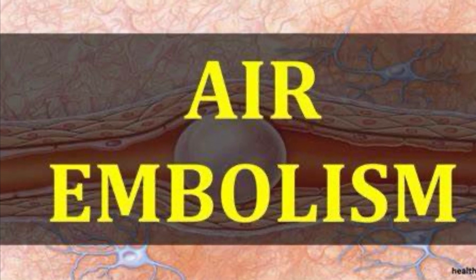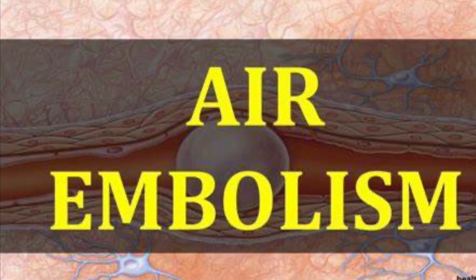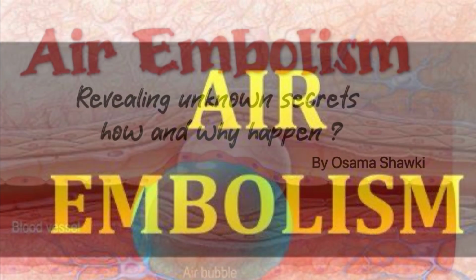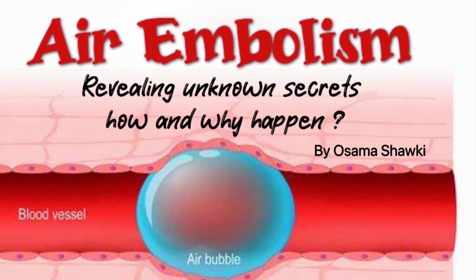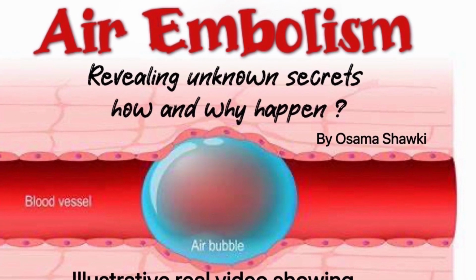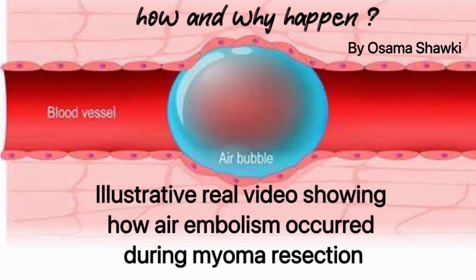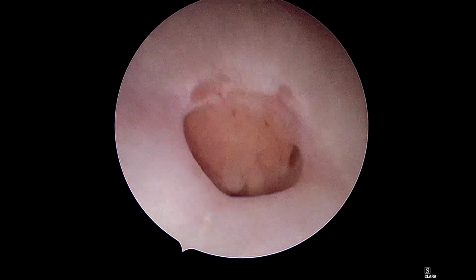One of the most catastrophic fatal complications with a very high mortality rate, air embolism, the nightmare of hysteroscopic surgery. In the coming video, let us share a case complicated by air embolism during myoma resection. We will see together, step by step, how and why it happened.